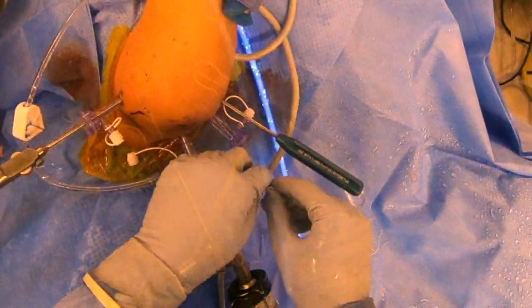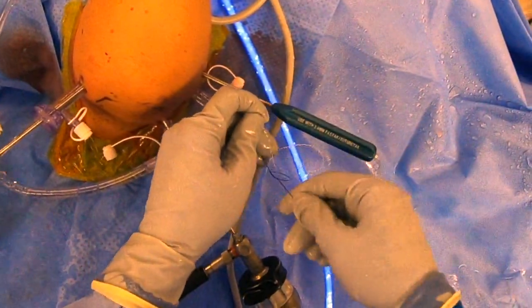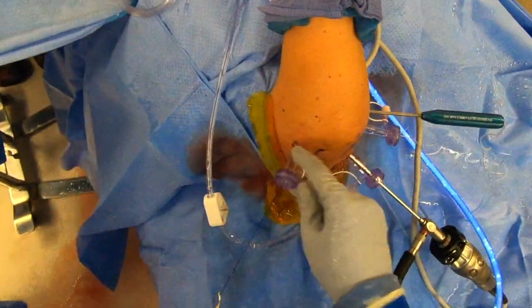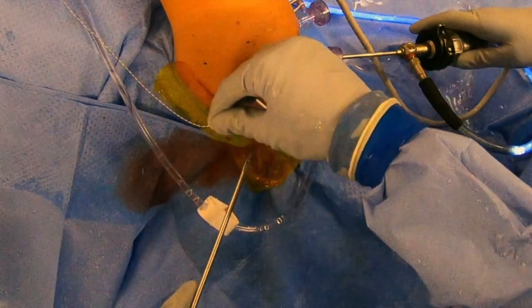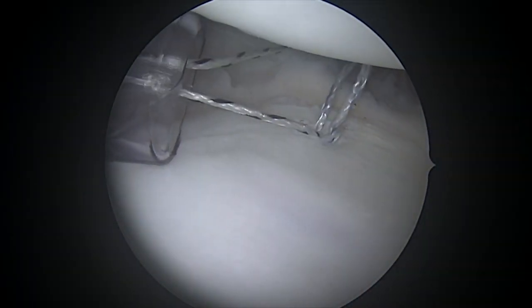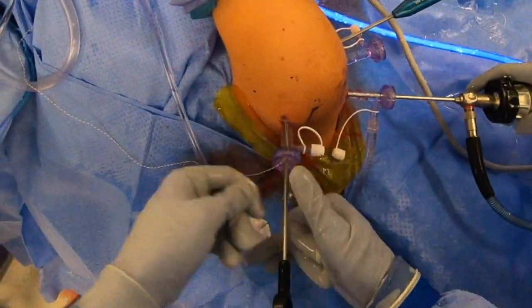When I tie that suture around, it's going to grasp the ligaments and bunch them up right next to the socket of the shoulder. When that gets bunched up, that's going to tighten the shoulder and prevent it from dislocating, which is the problem this patient is having. We use that little nylon loop to bring the suture back around, and once that's been passed, we can grasp the matching suture and tie them together, which will bunch that capsule up and complete our plication.